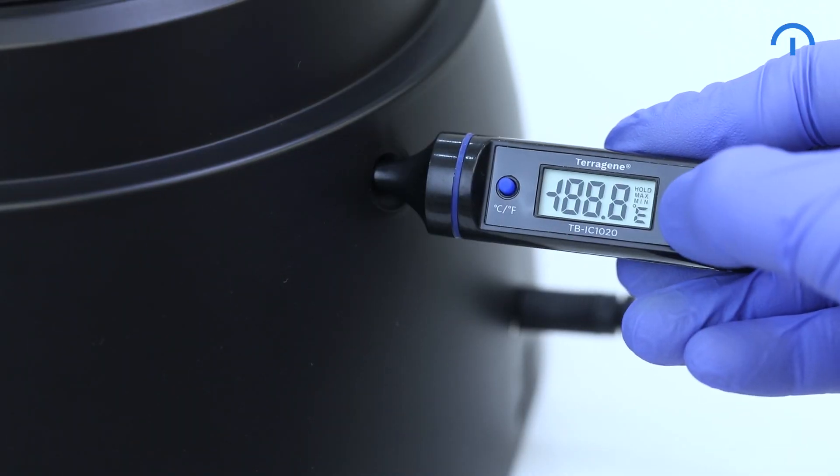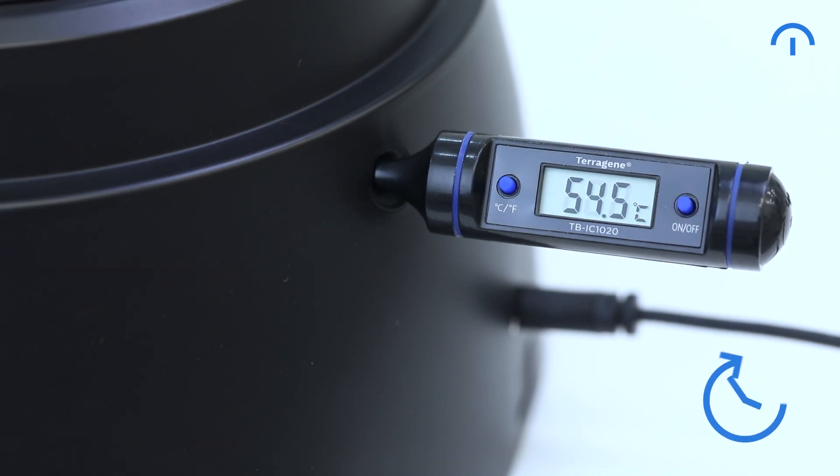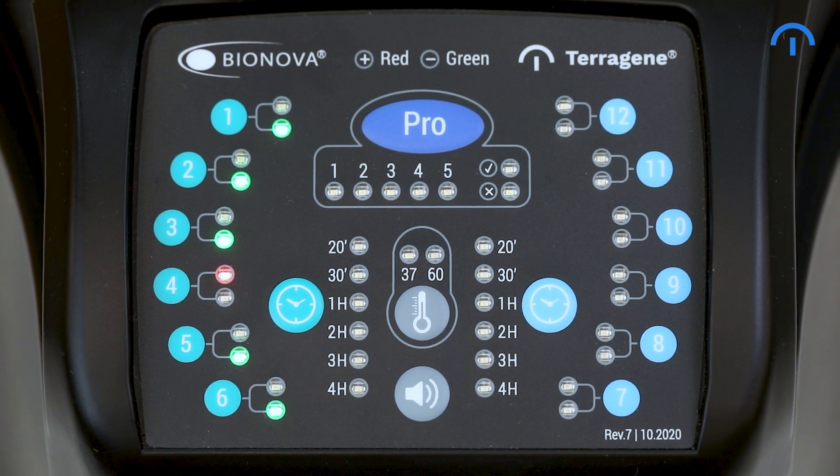You can use the external thermometer to verify the temperature. When the IC1020FR reaches the selected temperature, the autoreader will perform the positions auto test. Green lights indicate the positions are ready to use.